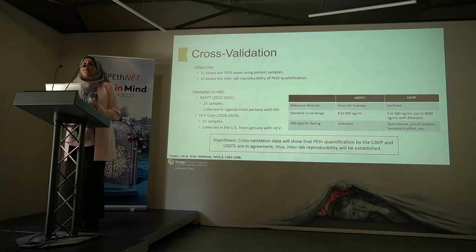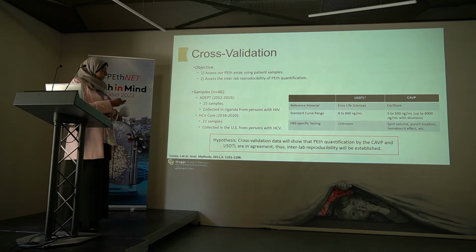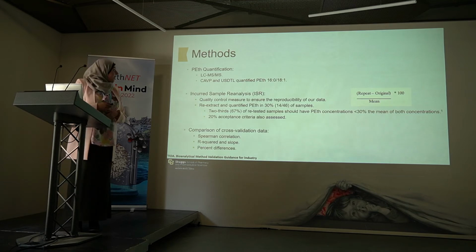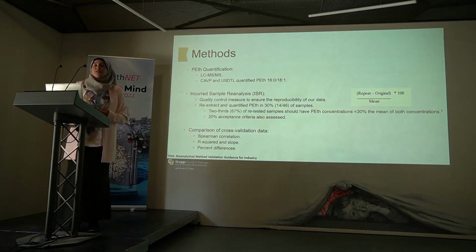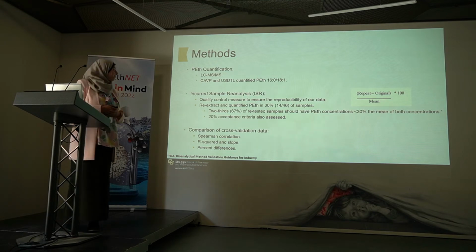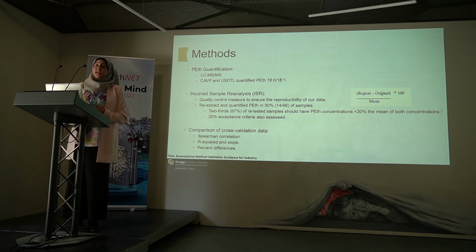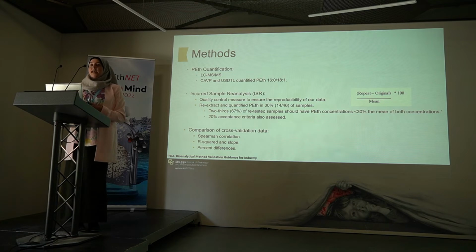But ultimately, we hypothesized that cross-validation data would show that PEth quantification by our labs would be in agreement, and thus we would establish interlab reproducibility. So for our methods, in terms of PEth quantification, both our lab and the USDTL utilize LC-MS-MS, and we both quantified PEth 16:0/18:1.